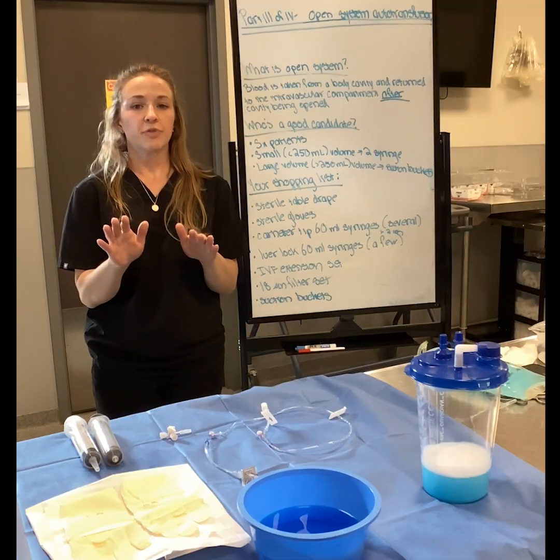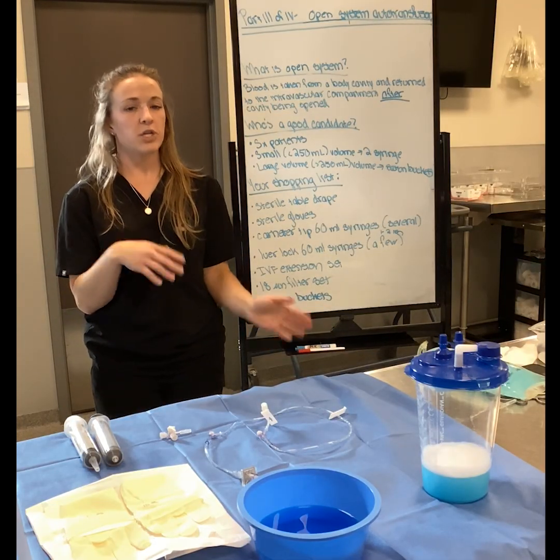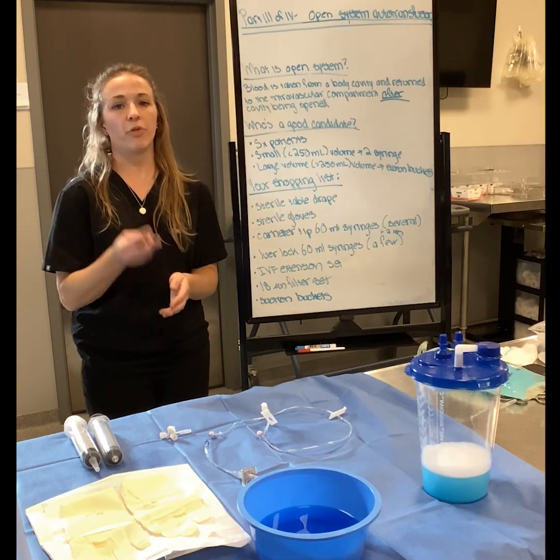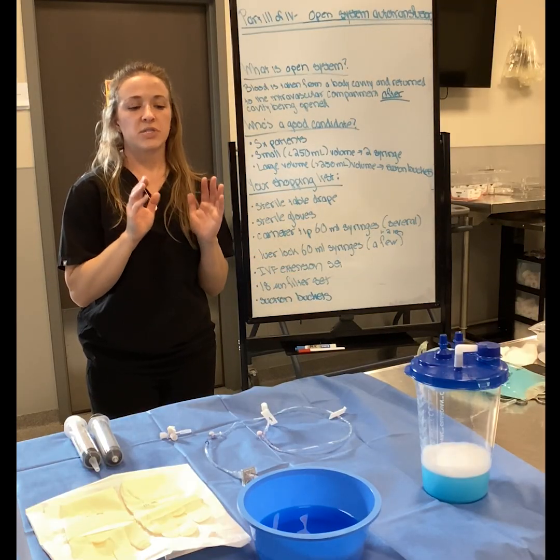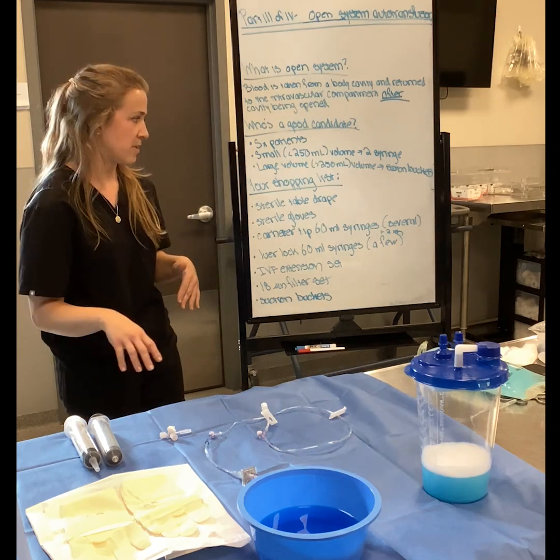Now, there are two different types that I use, and depending on the size of the patient and the size of the effusion, we are going to make the call about whether we use something called the 2-syringe technique, or we put the fluid, the blood, into sterile ETO gassed suction buckets.